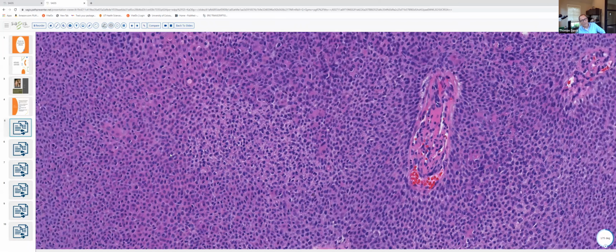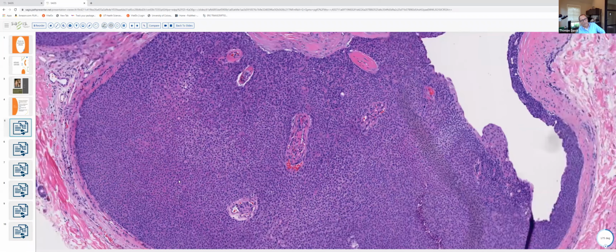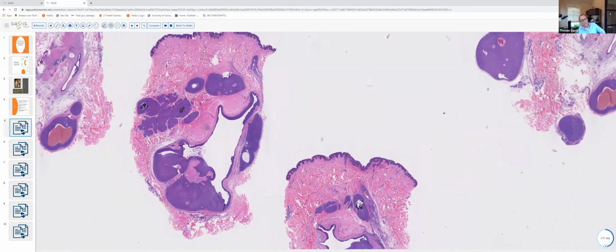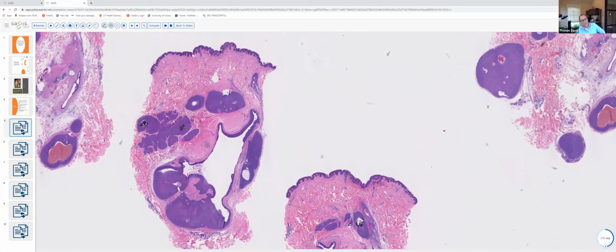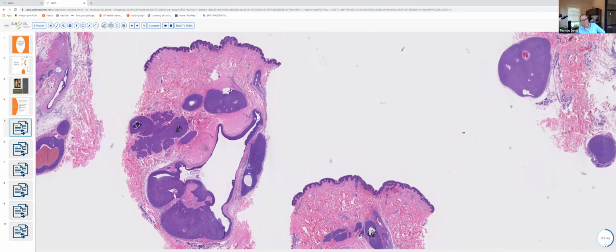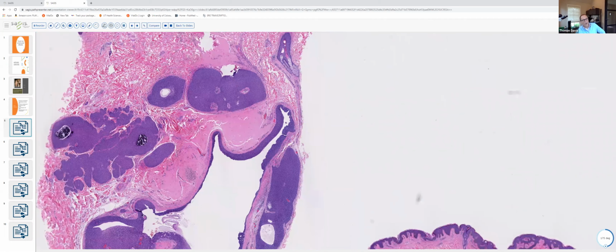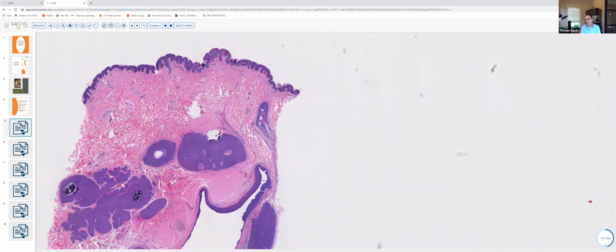Well, if we had tumor islands with this same makeup, in which there was attachment to the overlying epidermis and extension into the dermis, we would call it a poroma. If, on the other hand, we had these neoplastic aggregates, these poroid cells confined to the epidermis, we call it hidroacanthoma simplex. And then finally, if they're confined to the dermis, we call it a dermal duct tumor.